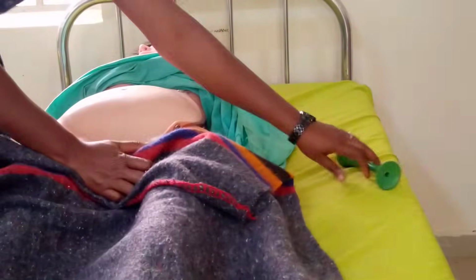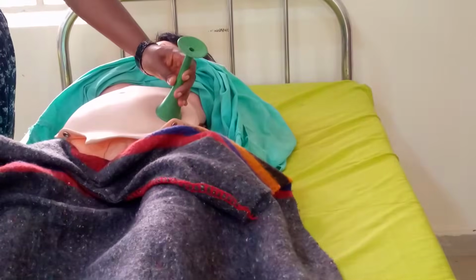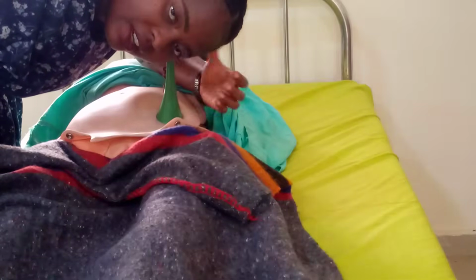So that's where you are going to be putting your pinard stethoscope. So by the time you put your pinard stethoscope there, you will now place your ear. Okay, then you don't touch the stethoscope so that it doesn't give you an extra noise.